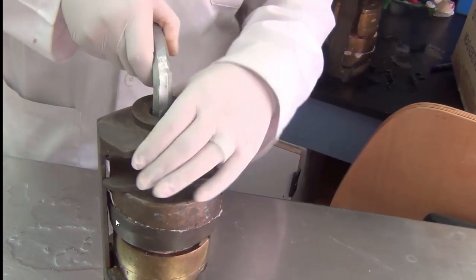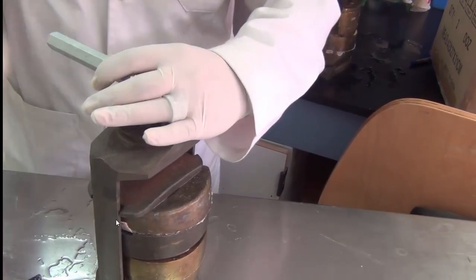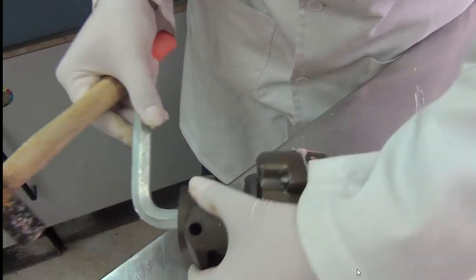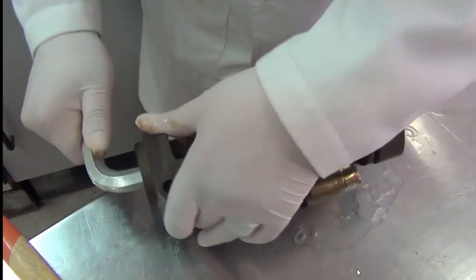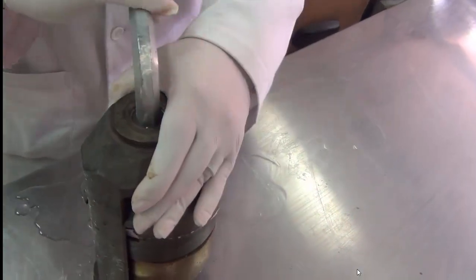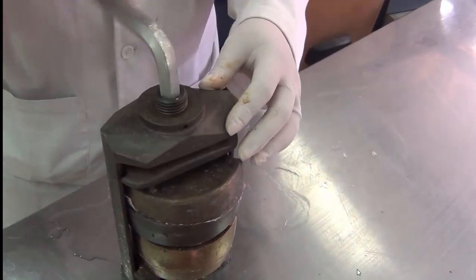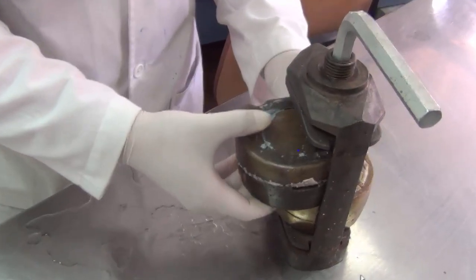So using the handle of the clamp, we open it, and because we have tightened it, we might use the hammer to release it. Once it's loose, we can just simply do it manually and loosen out the clamps. So the function of the clamp is to maintain this pressure all during the curing cycle. This continuous pressure on the denture during the curing will compensate for the shrinkage that happens during the procedure. Okay.